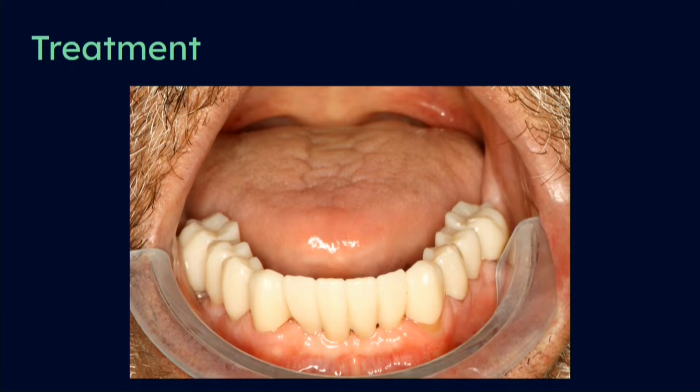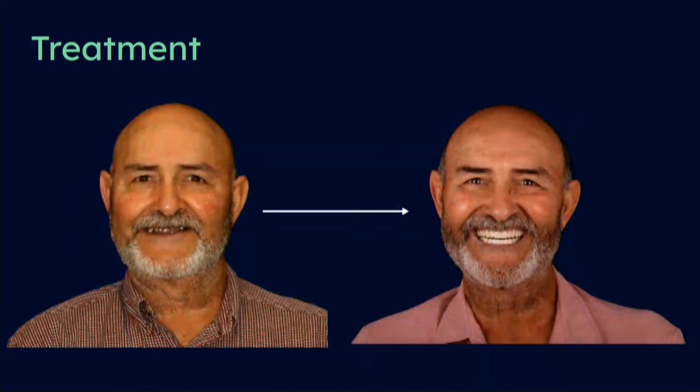Following the delivery of the mandibular crowns, we obtained a very nice rehabilitation for this patient with an option that ensures a long-lasting denture opposing this patient's mandibular rehab. In this example, digital dentistry allowed us to provide a complete denture with superior tooth properties given the patient's treatment modality, which would otherwise be compromised in the conventional workflow.